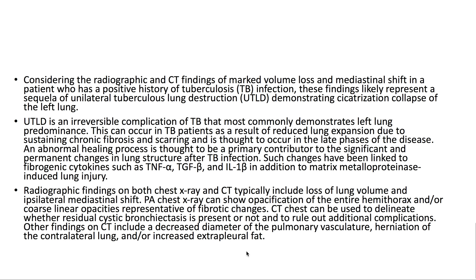Considering the radiographic and CT findings of marked volume loss and mediastinal shift in a patient who has a positive history of tuberculosis infection, these findings likely represent a sequela of unilateral tuberculous lung destruction, demonstrating cicatrization collapse of the left lung.